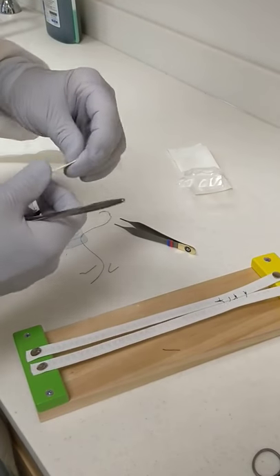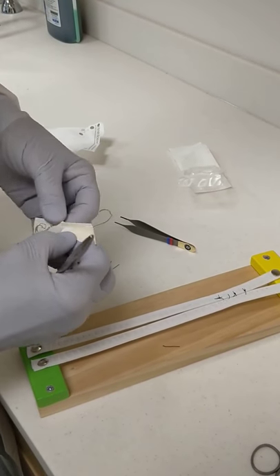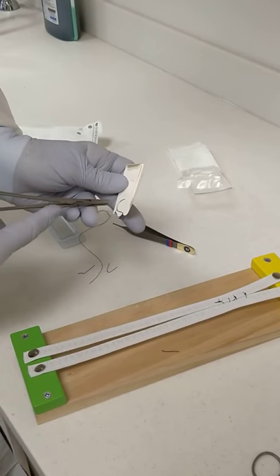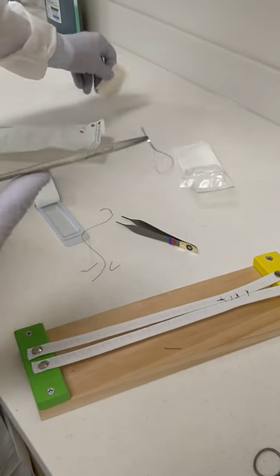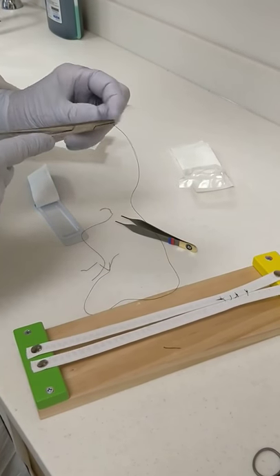The best suture when you're trying to suture, for instance, a quadrant of alveoloplasty, is the continuous locking suture.